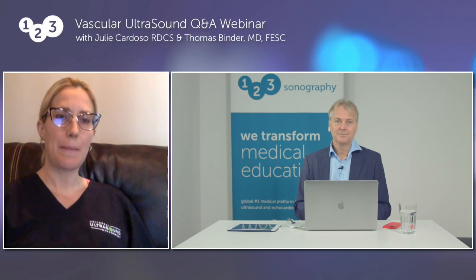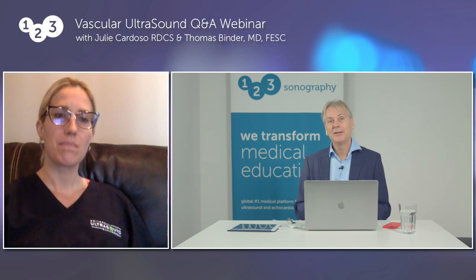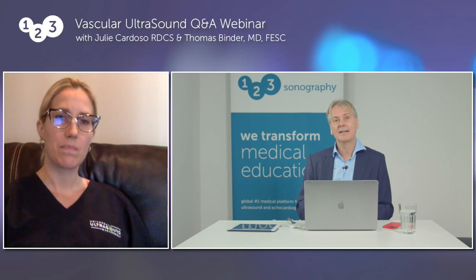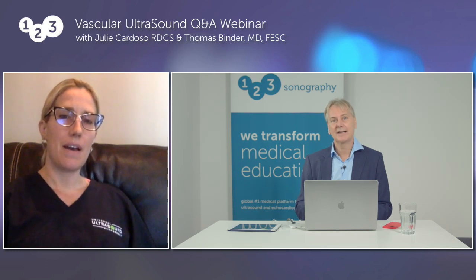So I'm a cardiology guy and we do echoes and we have very similar problems. We have the problem of patients being obese. Especially if you scan from the right side, you have to grip over the patient, and it's a lot of strain that you have on your musculoskeletal system. So very important tips here.